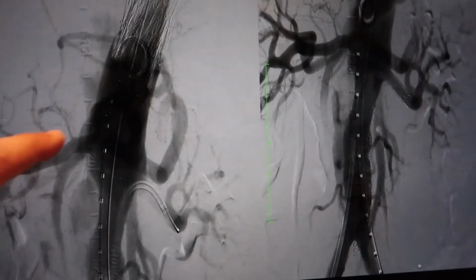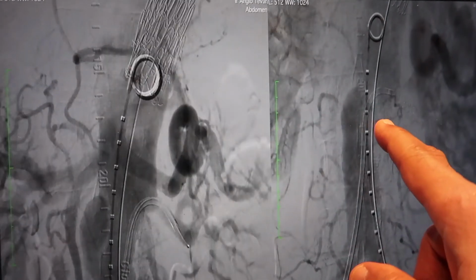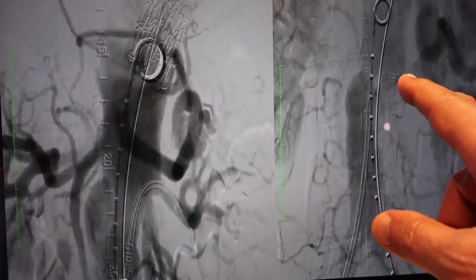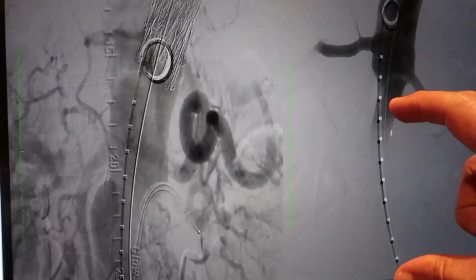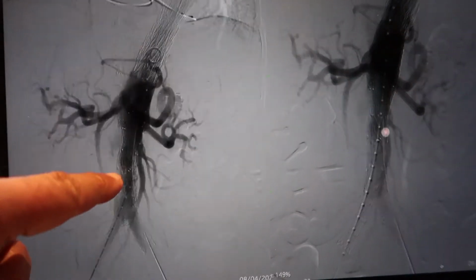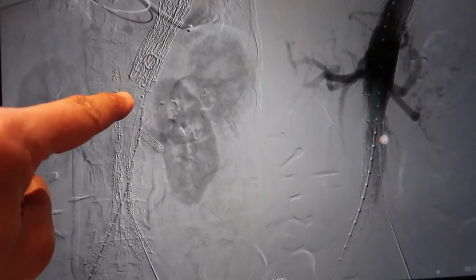And then after that, we went on to try to see what's happening. Still, there's some perfusion in here, and you can see the compressed true lumen into the infrarenal aorta. Because the length from the lowest renal to the bifurcation was 80 millimeters, we decided to use an AFX supplemented with a proximal Incraft stent. So we put the AFX in here. That's the Incraft 34. You can see the left renal and you can see the distal end.